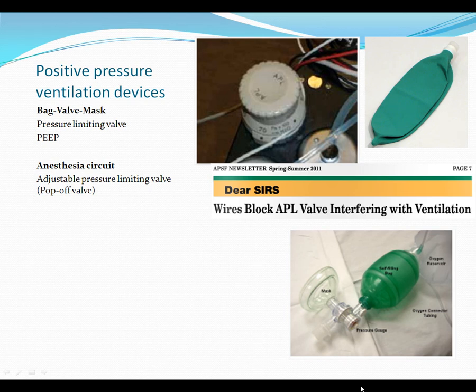With the APL, it's different from an ambu bag, right? Because when you squeeze the bag and you're dealing with an APL, if you have a tight mask fit and you have high fresh gas flows, when you squeeze the bag, you're not changing the pressures. It's when you release the bag, that's when they exhale. With the ambu bag, when you squeeze the bag, that's when you deliver your positive pressure breath.